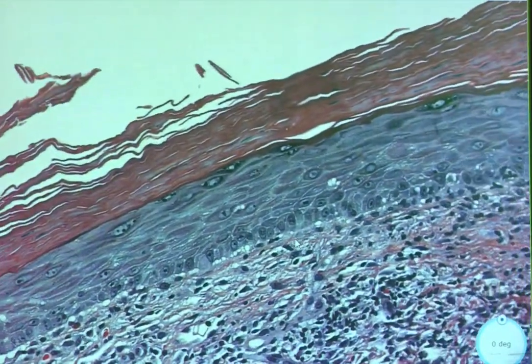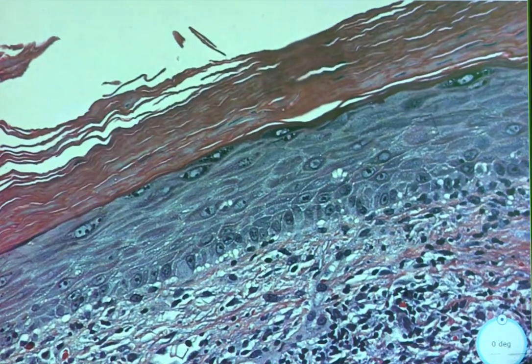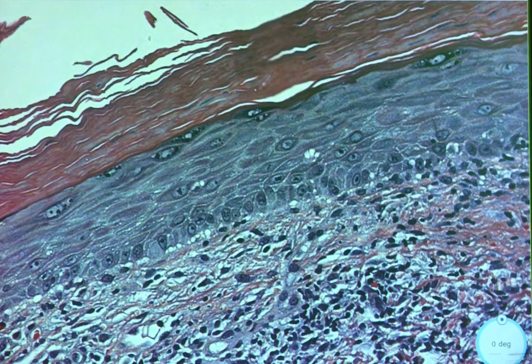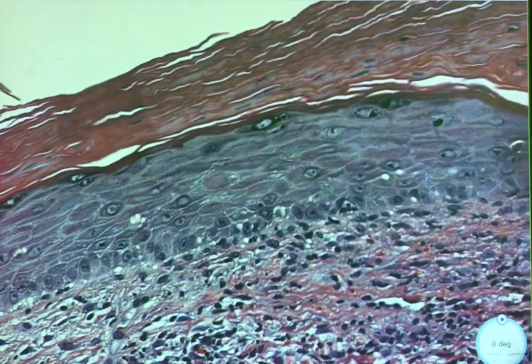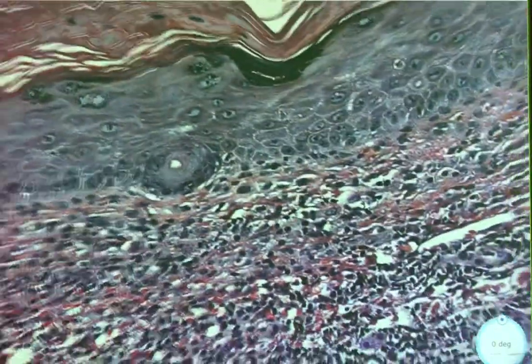I mean, the basal cell there, it's not as prominent, but it does show. It's not normal. Is there mitosis? Kind of is larger. Is this mitosis? So that is a mitotic figure. It might be, yeah. But that's at the basal layer, right? So that's okay. But these cells are just too big. They're too high up. You don't like that. That's a little unusual. Okay. That's been my dermatology knowledge.